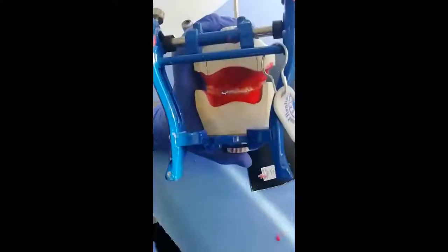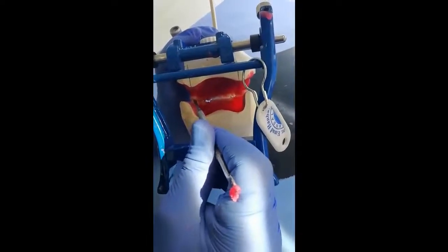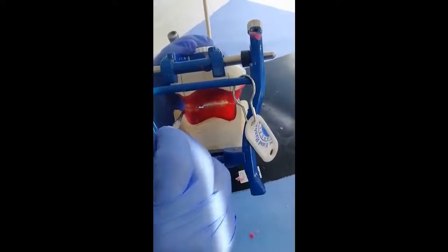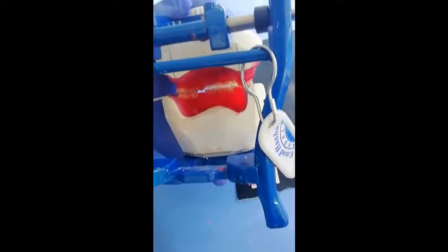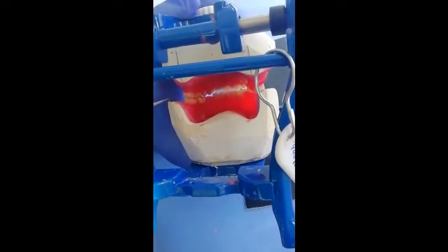As you can notice here, the maxillary palatal cusp of the second molar occludes in the central fossa of the lower second molar, and the lower buccal cusp, which is the functional cusp, occludes in the central fossa of the opposing molar.